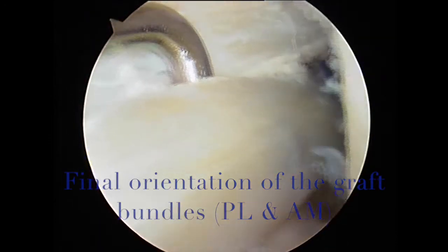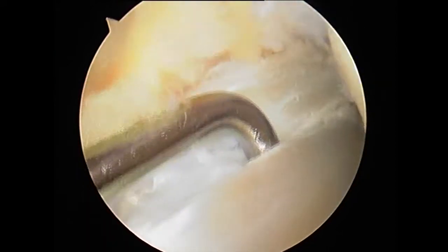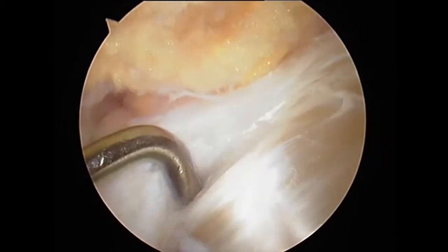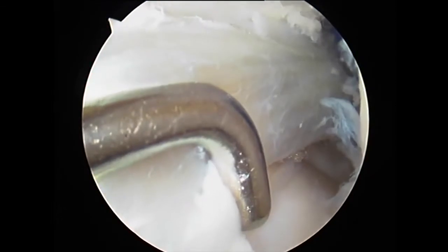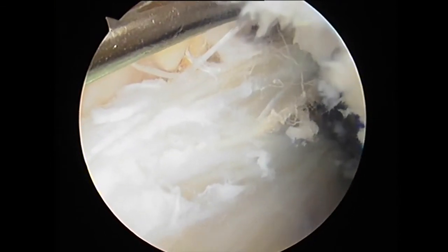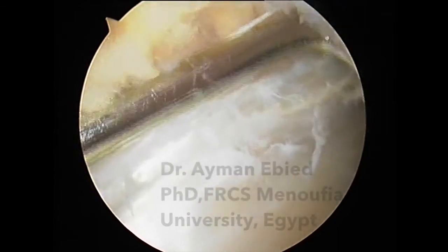As mentioned at the beginning, we are trying to replicate the anatomy. You can see the orientation of the graft, the two bundles that have been created, and the tension of the graft. I hope this video has shown some of the techniques and tricks for ACL reconstruction in my current practice for this operation. Thank you.